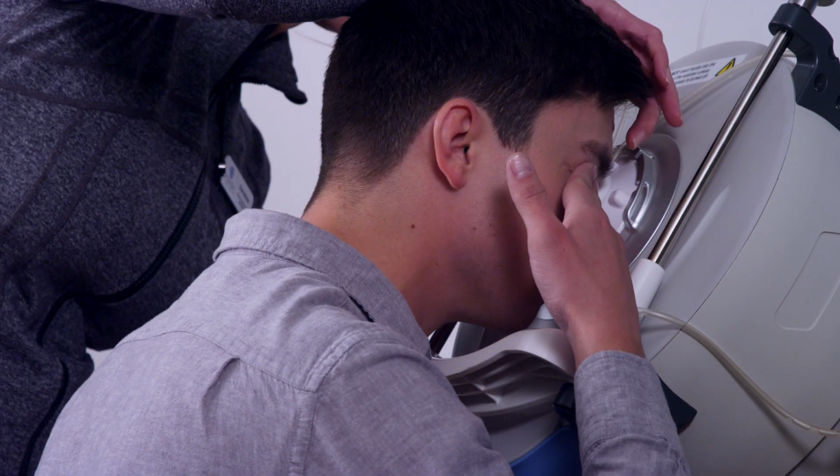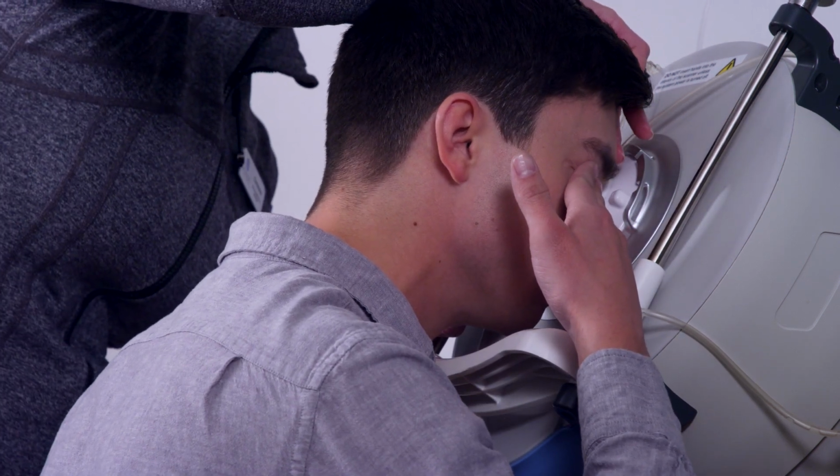With the patient maintaining that position, fill the EyeSeal cup, sometimes for prominent facial anatomy or to address a flatter facial anatomy. In order to have the eye as centered as possible, you may have a gap on the temporal side of the EyeSeal. Hold the EyeSeal against the temporal side to prevent leaking.